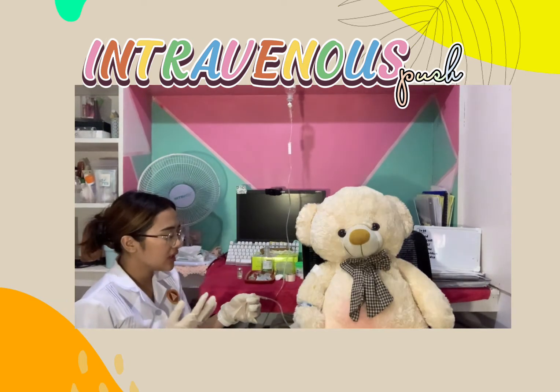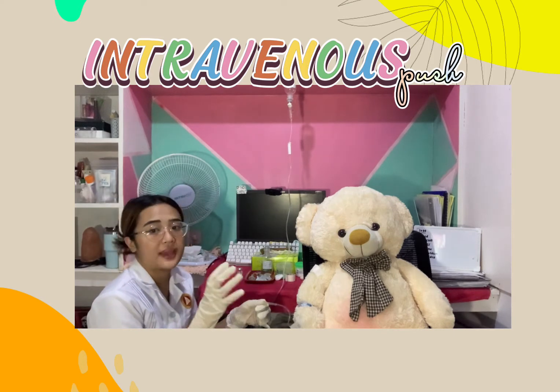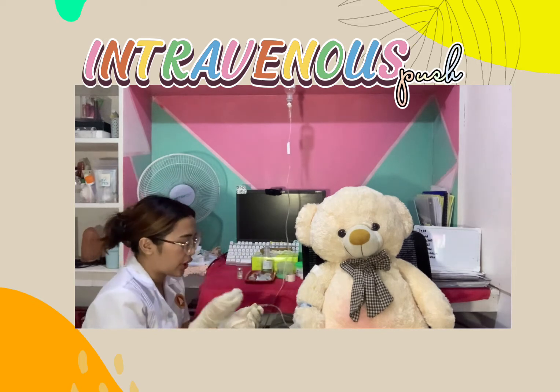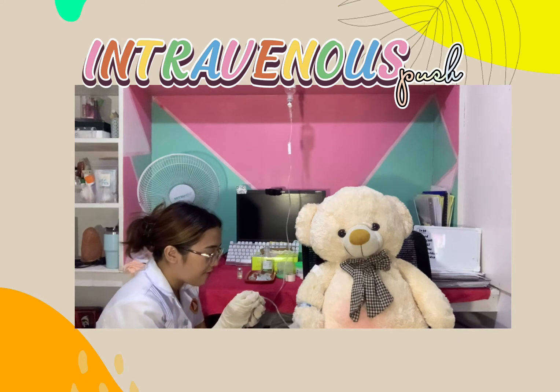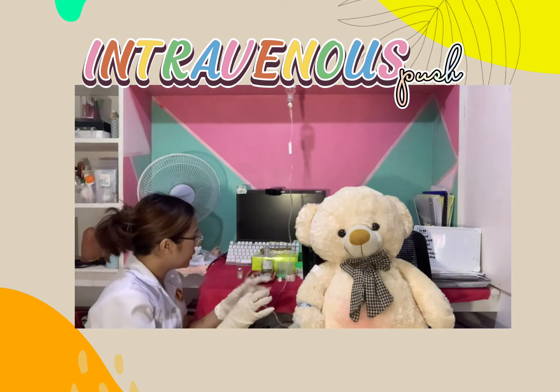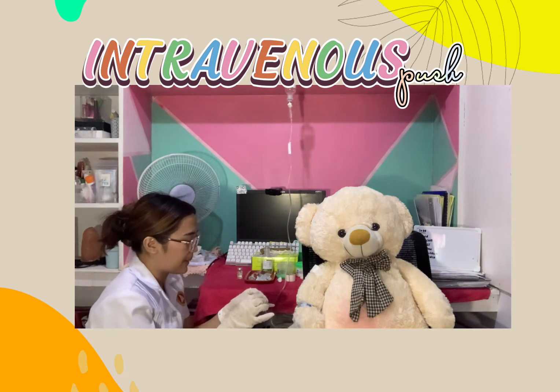So, after performing all of the steps, we can now proceed on the existing IV line. So, in here, we will find the injection port closest to the patient. So, after that, we will clean the injection port starting from the center going outwards for approximately 10 seconds. And then after that, we will now make sure to administer the ordered medication to the patient.